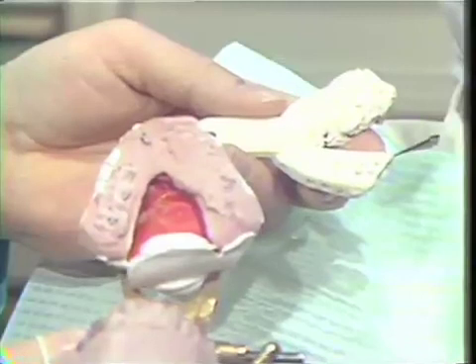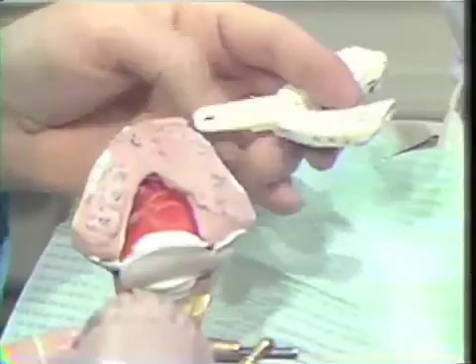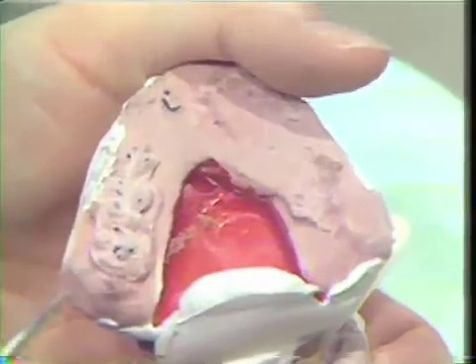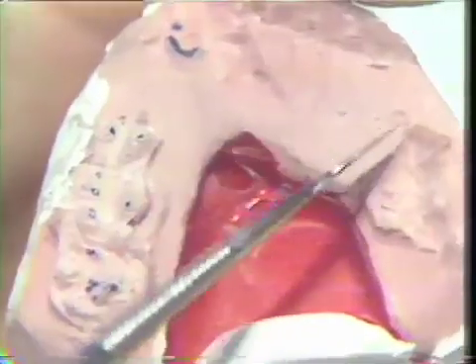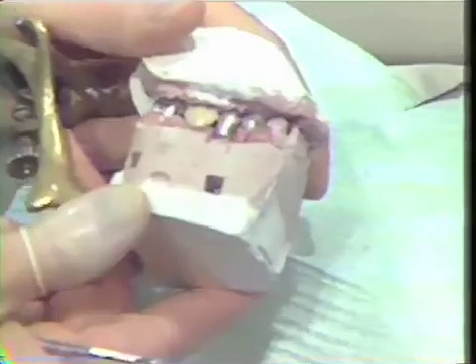The stone is now set, and we have removed the tray from the patient's mouth. It can now be mounted on the articulator, as we have done here, and you can see that we have captured the wax registration in stone on the side of the arch with the detail, and a minimal amount of the occlusion on the opposite side of the mouth, just enough to allow us to stabilize the cast on the articulator.